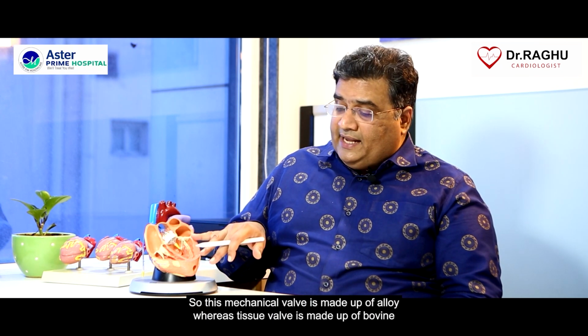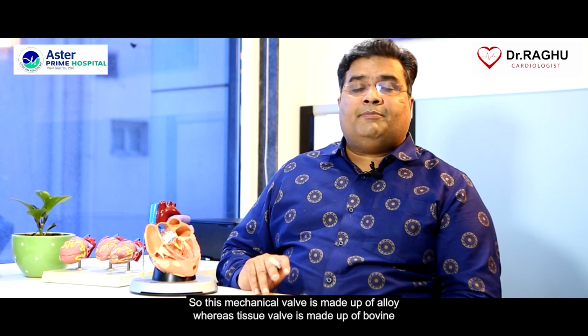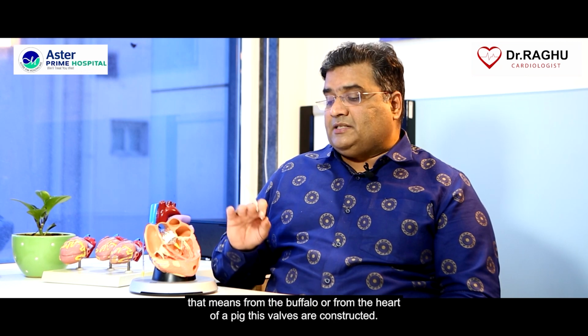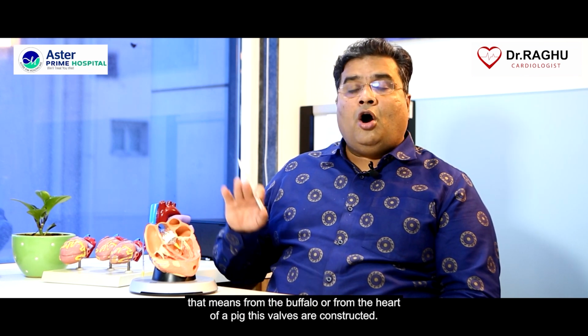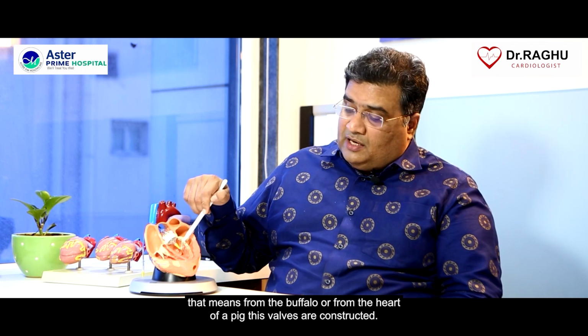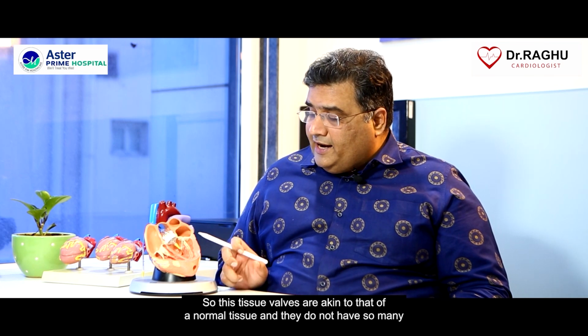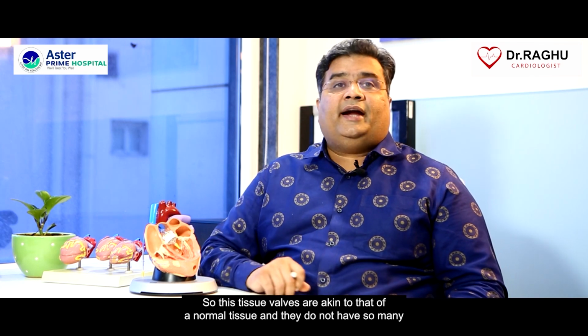The mechanical valve is made up of alloy, whereas the tissue valve is made up of bovine, that means from the buffalo, or from the heart of a pig. These tissue valves are akin to normal tissue and do not have so many complications.